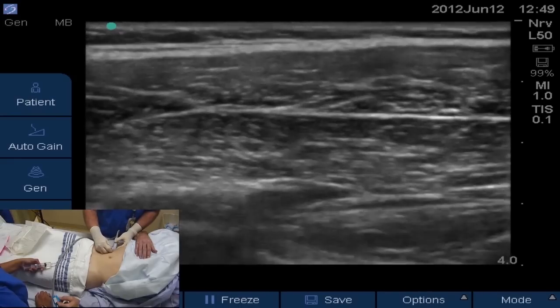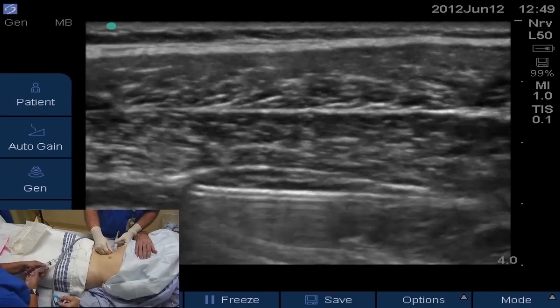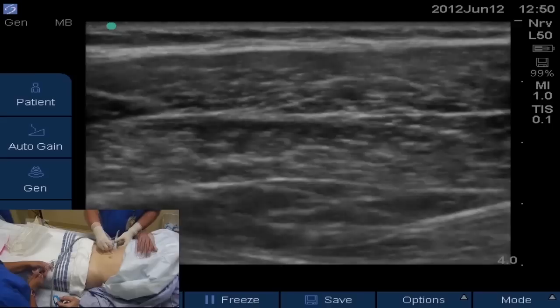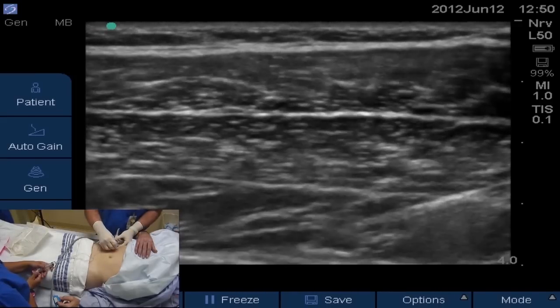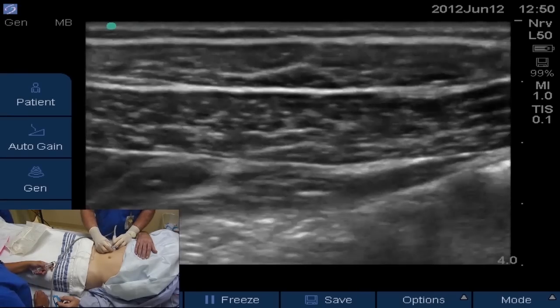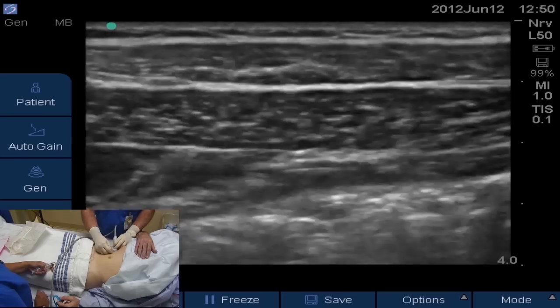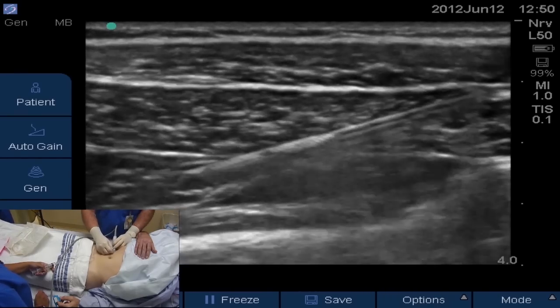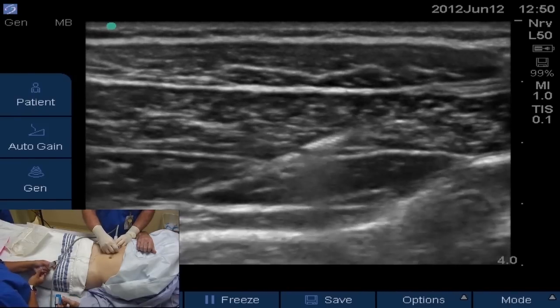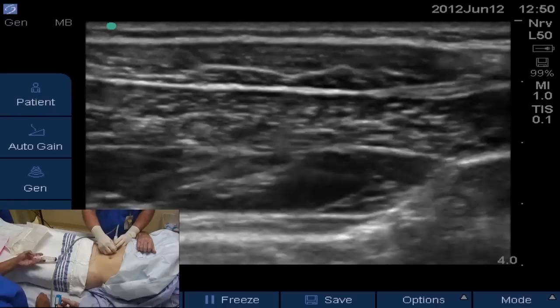You have to keep adjusting your probe to maintain that needle view. The TAP plane has been opened up with local anesthetic. We're going to inject some more, open up that plane, and keep advancing the needle more posteriorly. The beauty of this needle is when you come in at a steep angle — you can't come in with a flat approach like some blocks. This echogenic needle really helps you see exactly where your needle is at an angle, because those last two centimeters allow you to see the tip, feel the pop, and actually see the pop when you enter the TAP plane.